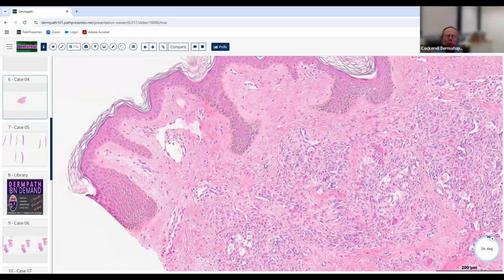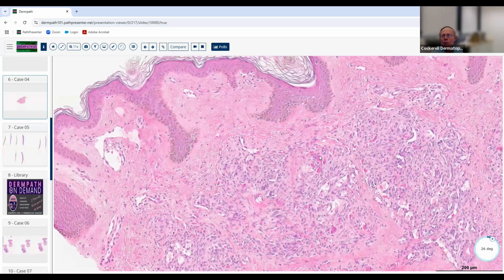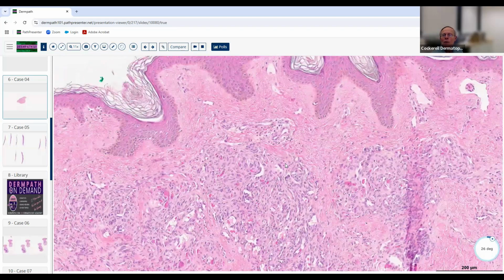We can look at this and say, yes, this is a vascular lesion, and it's an angiosarcoma, and it looks relatively well differentiated. Sometimes you look at these angiosarcomas and they're super atypical with a lot more mitoses, a lot more striking atypicality and pleomorphism than we see here. And in this situation, this was actually a fairly reasonable biopsy. They took a good deep punch biopsy here. It's probably about a 6 millimeter punch, which is good.